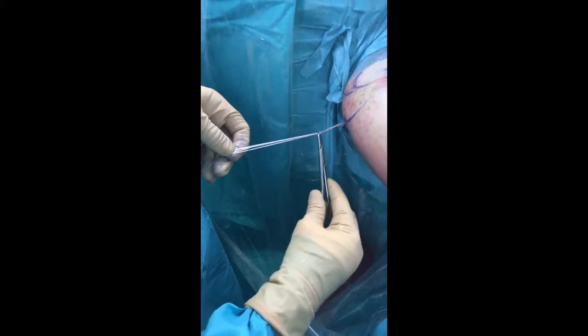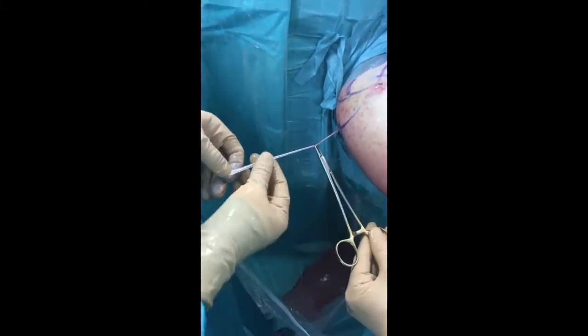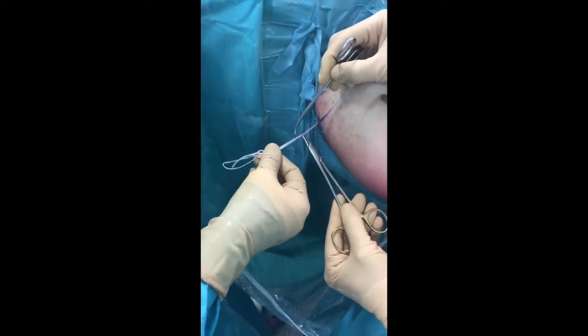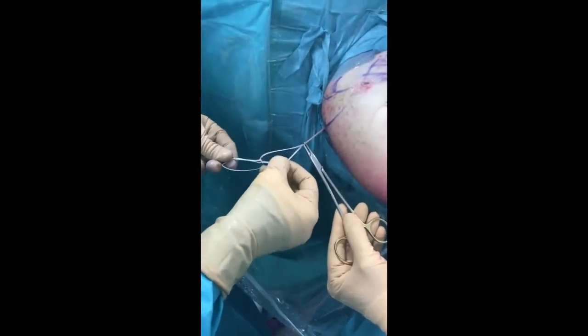The second button is then loaded over the sutures, then the two loops are separated and a nice knot is made. The button is cinched to the posterior glenoid without tension.